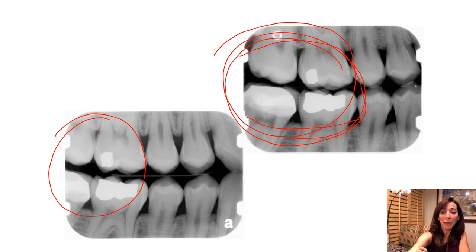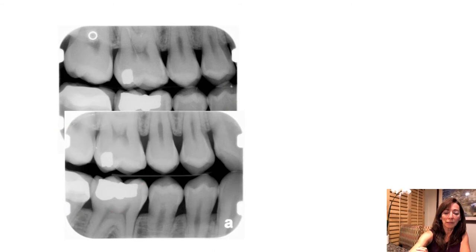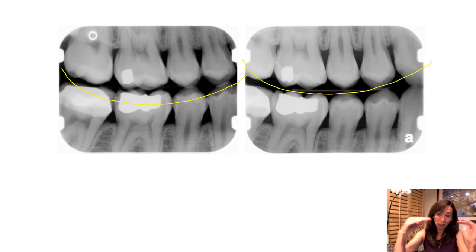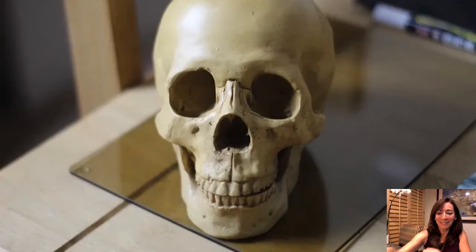So the molars are going to go to the back, and the premolars toward the front. Here's another clue you might notice: see that little smile? That little grin? The curve of Spee. Sometimes when you have all four of the bitewing x-rays together, there will be a little grin, letting you know you did a great job mounting. See that little grin?